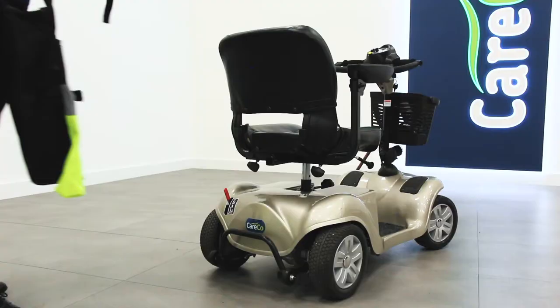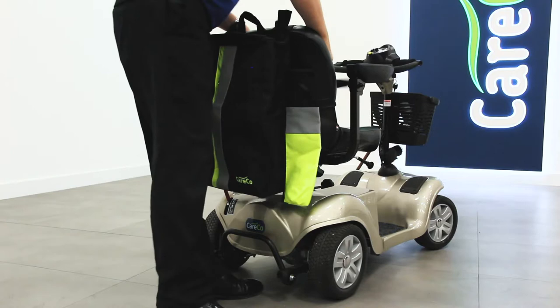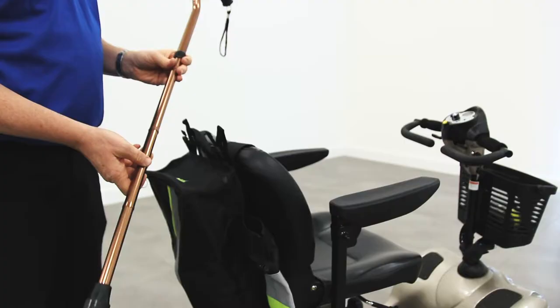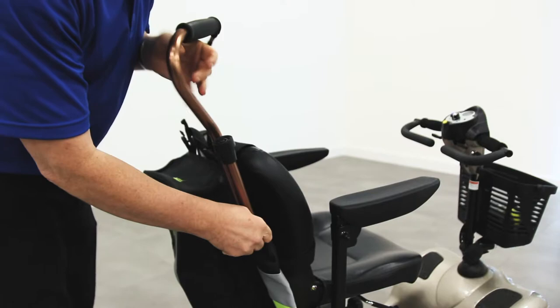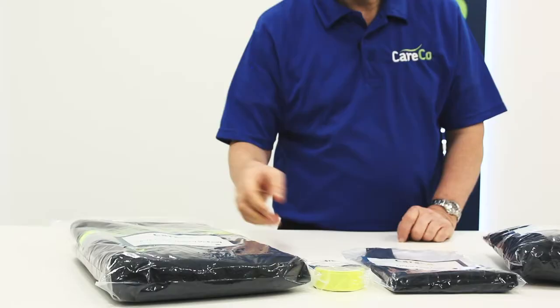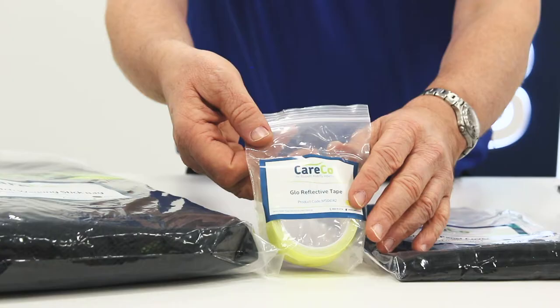The first accessory included in the pack is the Careco Hi-Viz crutch and walking stick bag. This multi-purpose bag attaches to the back of your mobility scooter and has a huge amount of space for all your belongings, as well as dedicated holders for your walking stick or crutches. The bag is adorned with reflective material strips, keeping you safe and seen at night.